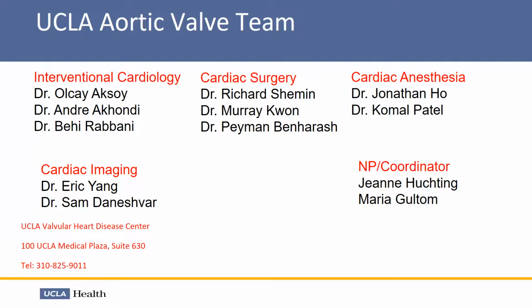When people looked at the 30-day and longer-term follow-up, they saw things like atrial fibrillation associated with strokes. What that PARTNER study made me worry about is that we're leaving the old valve behind. So there's always this concern of what if pieces of calcium are there, or you form a little thrombus there. There's always a debate about what the ideal regimen is. Do we do aspirin? Aspirin and Plavix? Do we do more blood thinners for a couple of months? Different institutions have different practices.